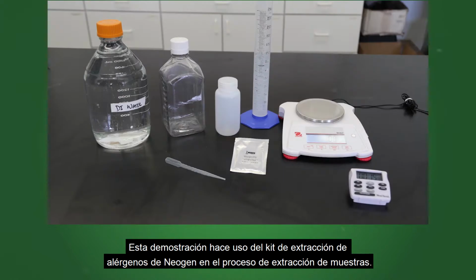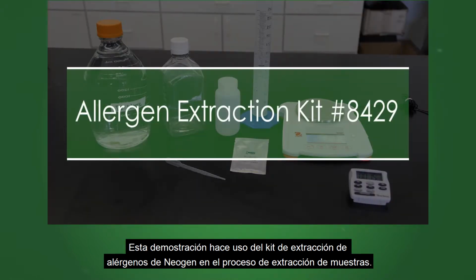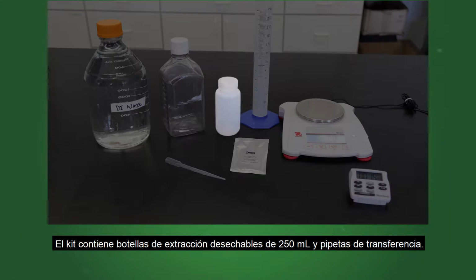This demonstration makes use of Neogen's allergen extraction kit in the sample extraction process. The kit contains 250 milliliter disposable extraction bottles and transfer pipettes.